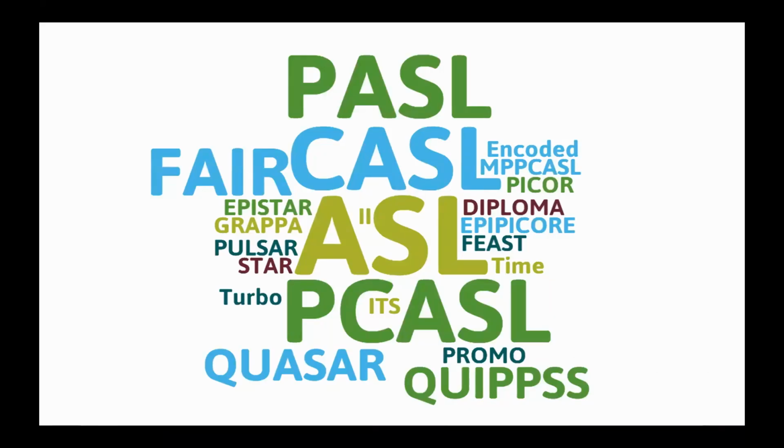Now, many of my colleagues often find it confusing or difficult to understand the different ASL techniques and their acronyms, like the ones that I'm showing you here. And actually, the bigger the size of each technique, the more popular it has been used. But I always tell my colleagues that no matter how funny the names are, their goal was either to improve the quality of the ASL data or improve the accuracy of the perfusion measurement.